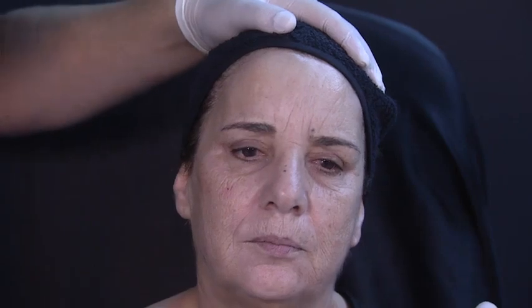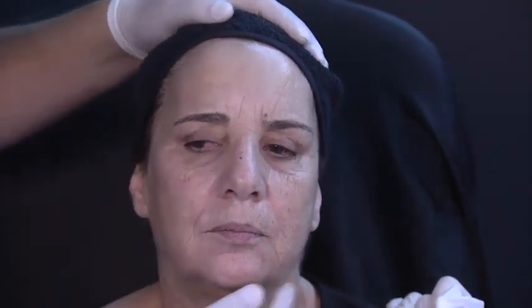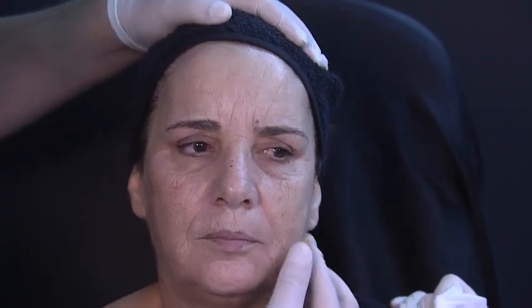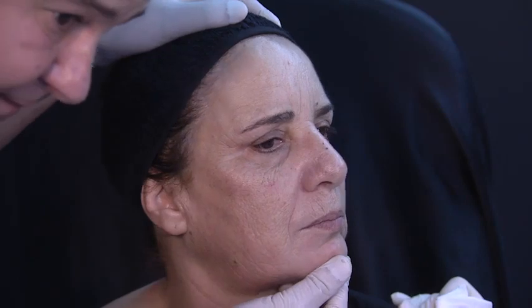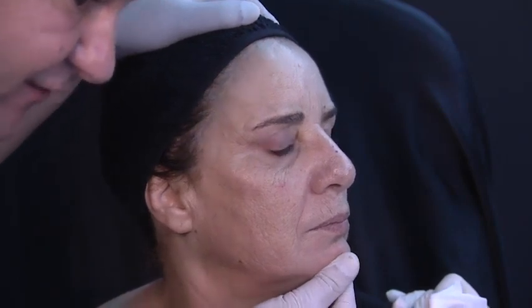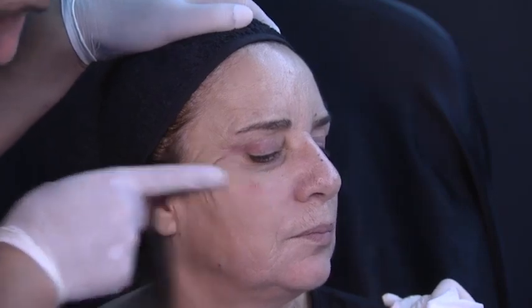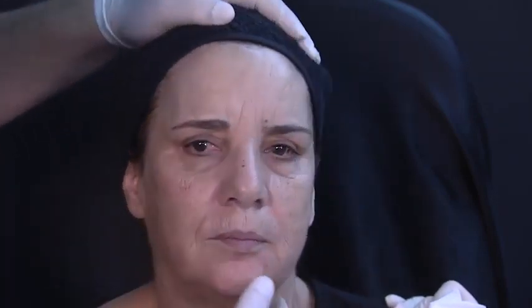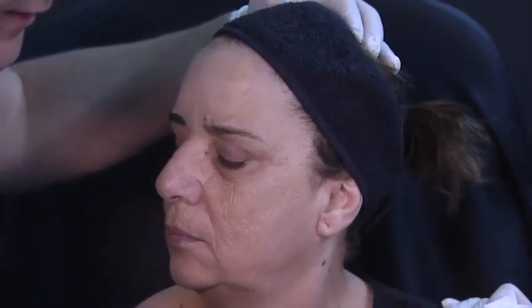So I just want to highlight, can we sit up my patient? I just want to highlight that I only injected 1 ml, okay? And we can see the shape here. We can see how we are actually lifting this skin. Okay, look at this. If we see her on profile, you can see that we have not over volumized her. Although we can see the shadow here and a higher cheekbone. We're going to do a lot more things on her mid face today.